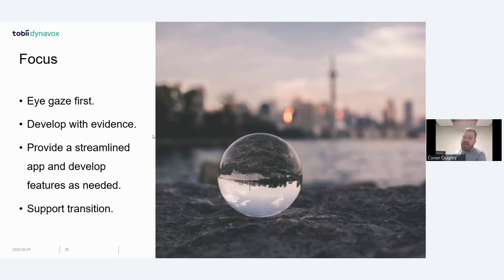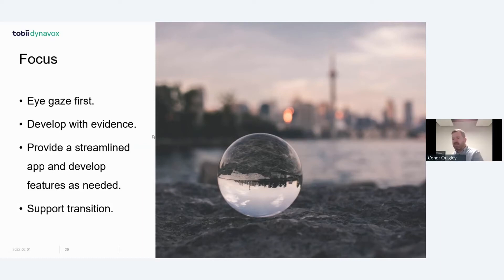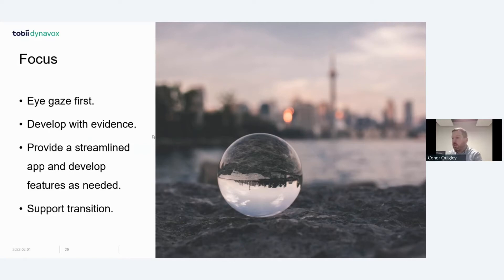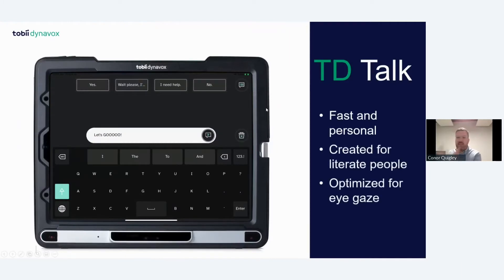If you have somebody who may be progressive and you want to start on an iPad, getting used to a communication app and exploring their system, they can do so on TD Talk. Then if they do require a TD Pilot in the future, their history and app content will transfer with them into TD Talk. It's fast, it's created for literate people, and it's optimized for eye gaze — essentially a one-screen app.